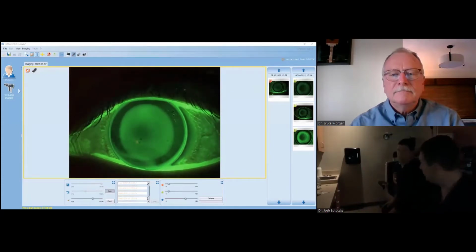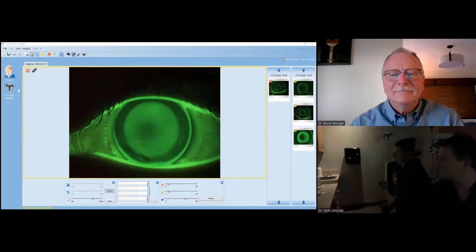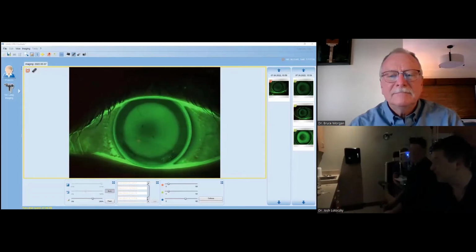And what did we even put on this side? No. Bear in mind, this one just went on, and I put fluorescein in, and there's a little bit more than I want to see. You'll start to see that central pattern maybe popping through just a little bit now, but obviously that looks a lot different than the last one I showed you.